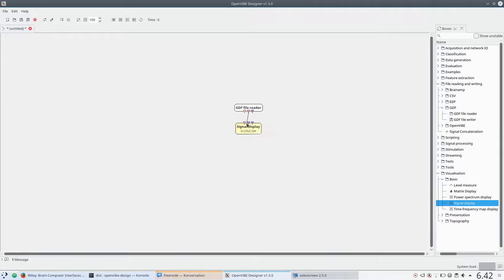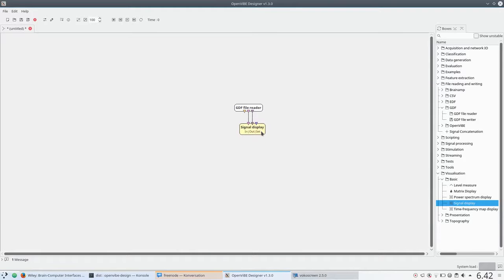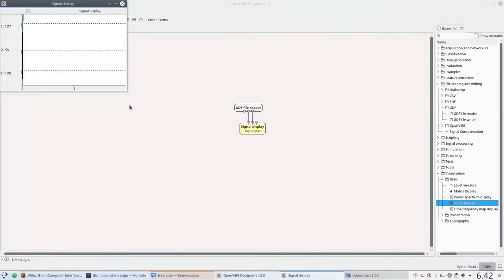You need to connect up both the raw signal and I believe this is the stimulus channel, and we'll just go ahead and hit play.